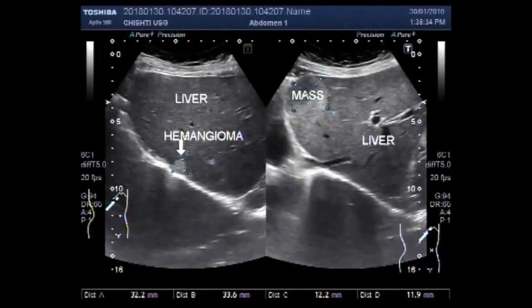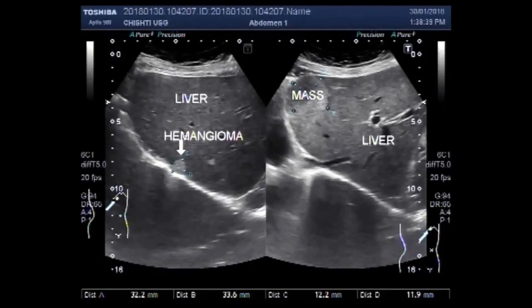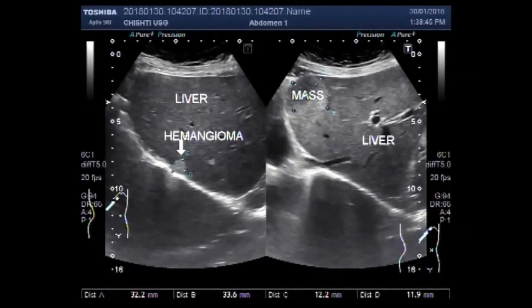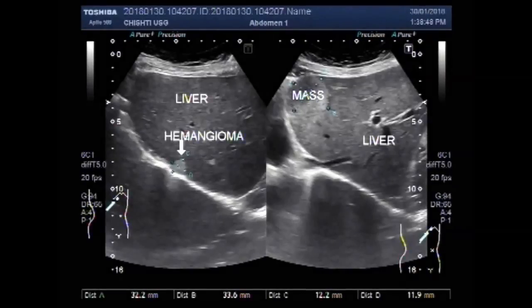Dear viewers, I hope you are all fine. This ultrasound video shows a hepatic mass and a hemangioma along with this mass.